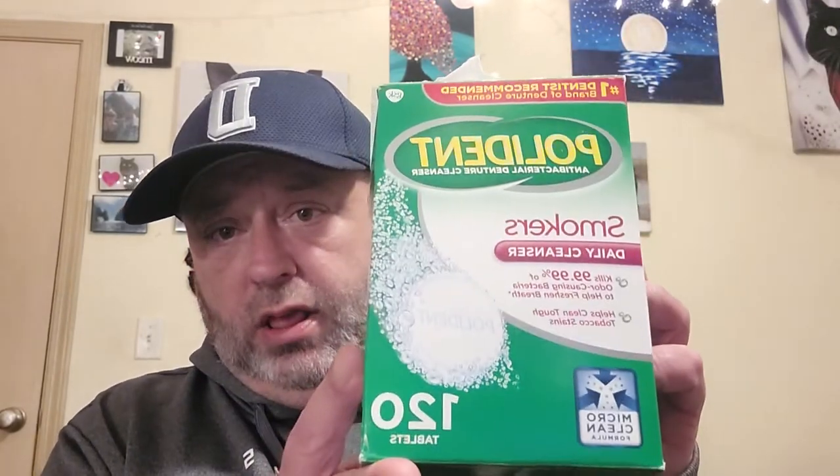If I'm soaking them overnight I've got a wide variety of options - no one ever just has one thing it seems. I've got a Kroger brand antibacterial tablet that says 15 minutes. I've got a Walmart brand that says three minutes - same thing, 99.9% kills bacteria. But what I've been using lately is a Polident Smokers tablets, 99.9%, which I think is also a 15-minute thing.